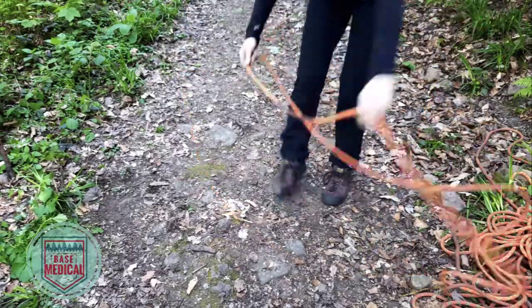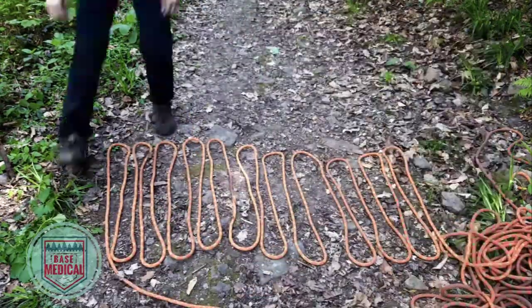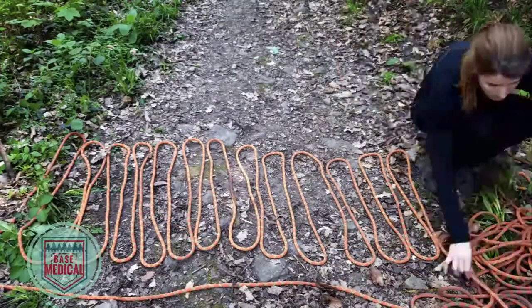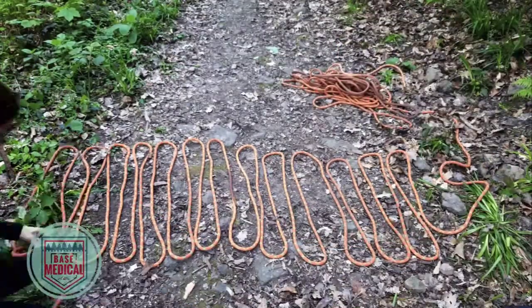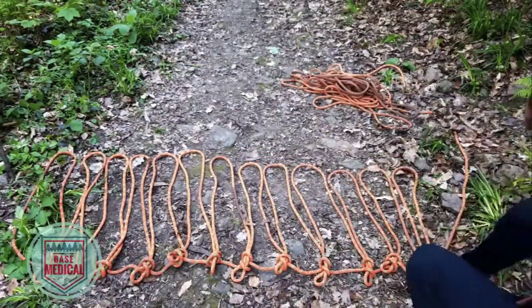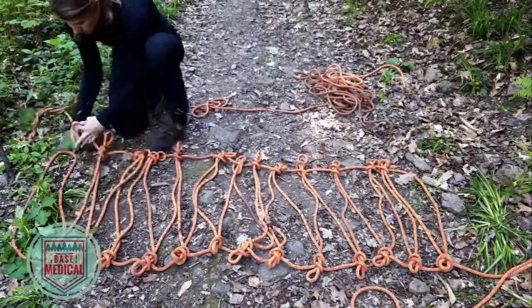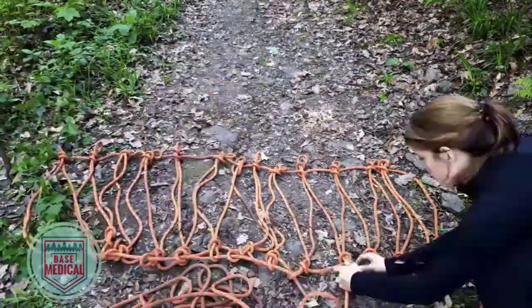Find the middle of the rope and lay down a zigzag pattern that is one foot wider and one foot longer than your patient's width and height. Attach the rope ends along each loop using clove hitches. Thread any remaining rope through the loops. Poles or branches may also be threaded through the loops for extra stability.